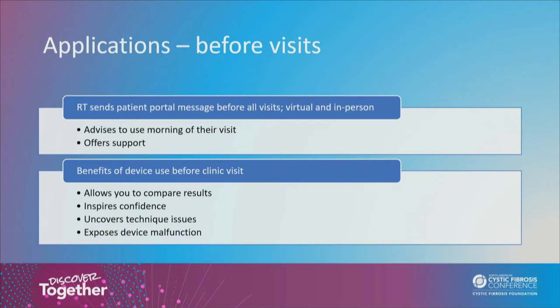Next, we began several applications we hoped would assist with the program's acceptance and long-term success. Before all visits, virtual or in person, the patient receives a message through the patient portal advising them to use their home spirometer the morning of their visit. This message also offers support if needed. We feel using the device before a visit has many benefits. It allows the provider to compare the results to their in-clinic result and also helps to inspire confidence in the results from the home spirometer.